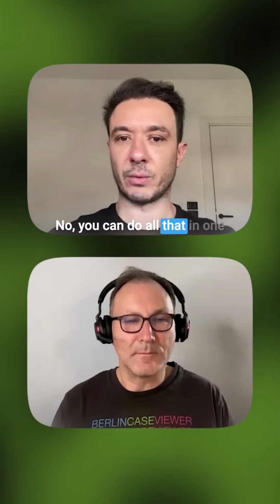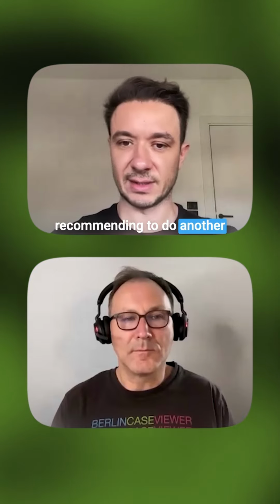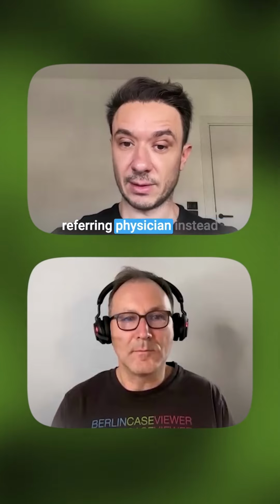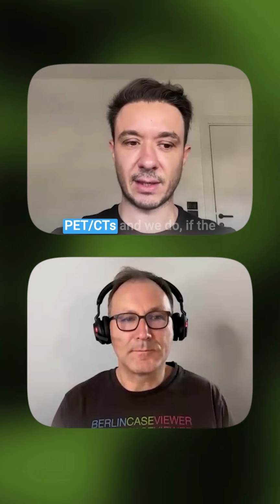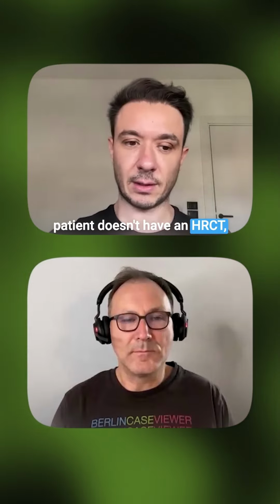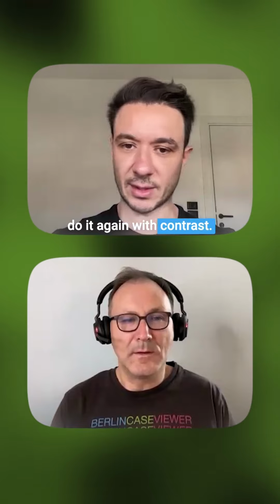You can do all that in one PET-CT scan instead of just recommending another CT scan and all of that. So it would definitely help the referring physician instead of delaying the patient's treatment. This is what we do at our institution. We now do PET-CTs, and if the patient doesn't have an HRCT for the chest, we would do it with the PET-CT instead of just recommending to do it again with contrast.